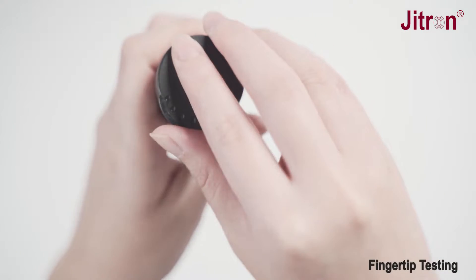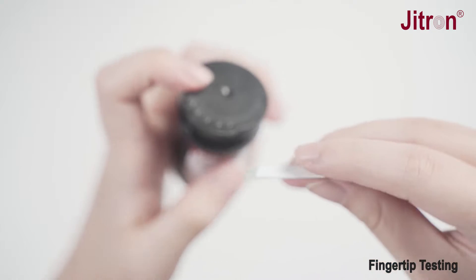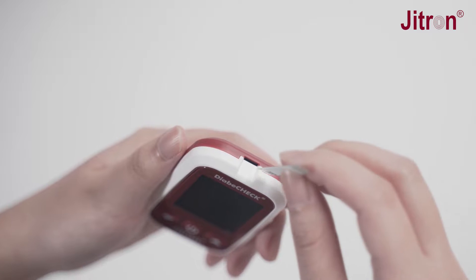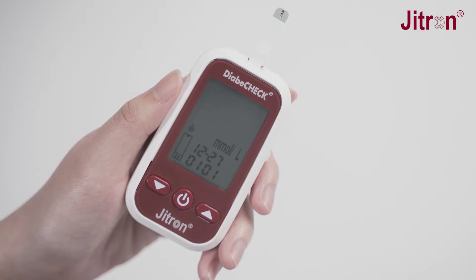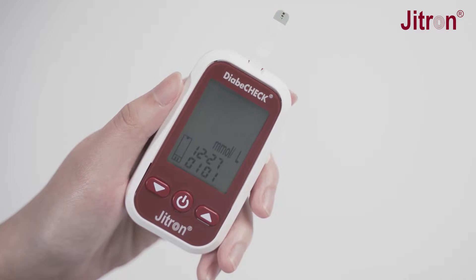Take out a Diabicheck test strip from the bottle and close the bottle immediately. Insert the test strip to turn on the meter. Wait for the flashing blood drop and test strip icons to appear on the meter display screen.